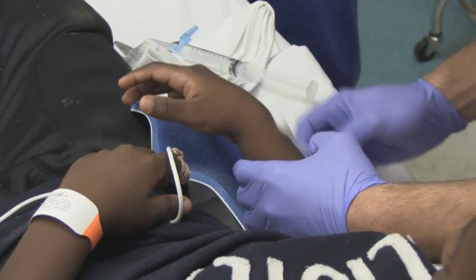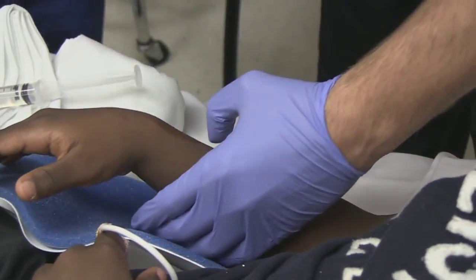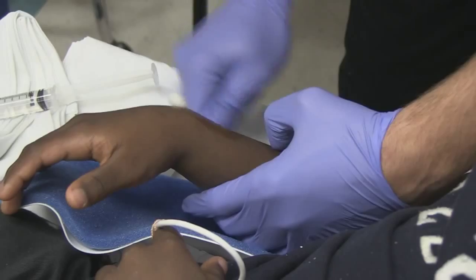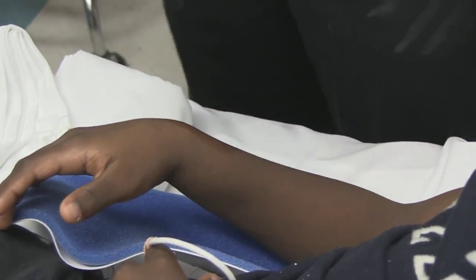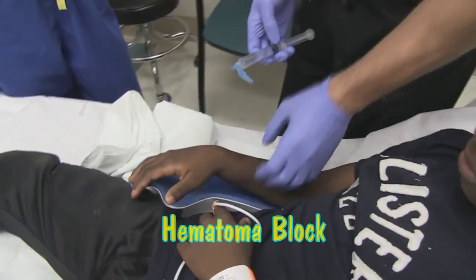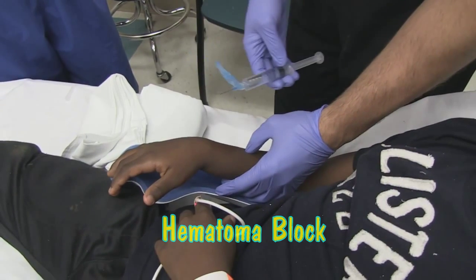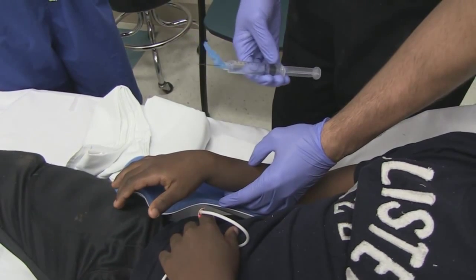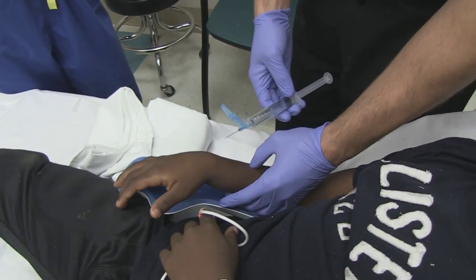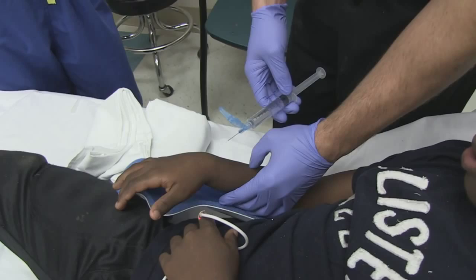Oh, this is right there. So this is just a hematoma block — fracture reduction. Basic thing: just sterile prep it, and then a couple cc's of lidocaine is fine. Things to remember with the wrist joints: usually always a little more proximal than you anticipate. Most people tend to go too distal. Just err on the side of more proximal, and you'll usually find it okay. You should get a good drawback of hematoma to let you know you're in the right spot.